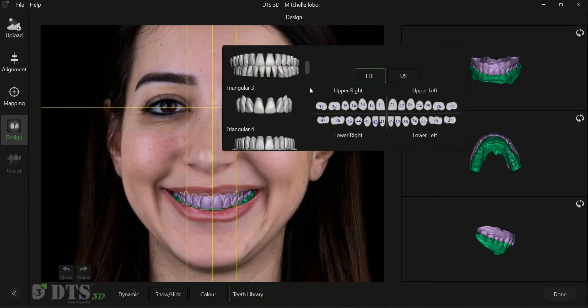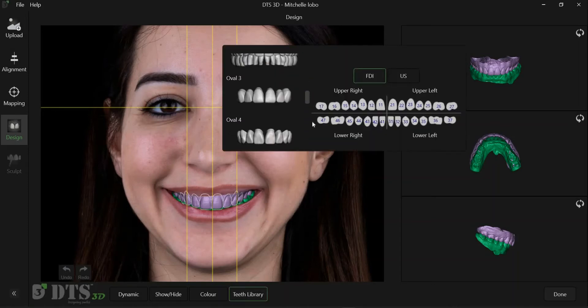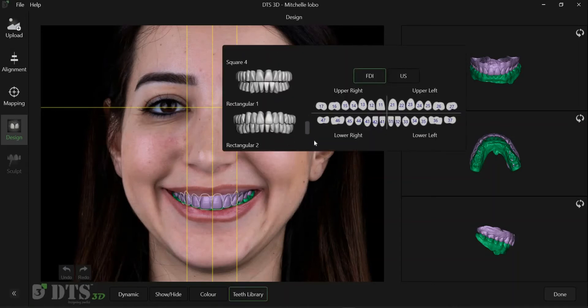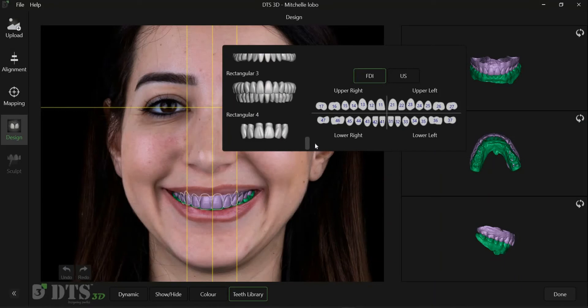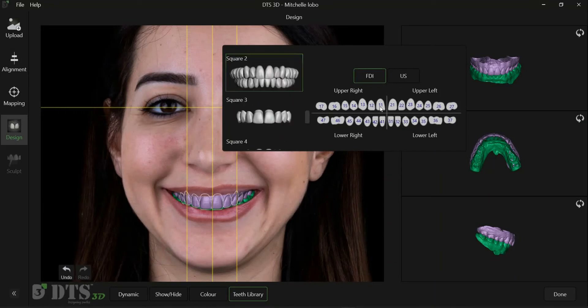DTS3D has a library for all natural tooth shapes and sizes. We can insert anywhere from a single tooth to multiple teeth of the desired shape.